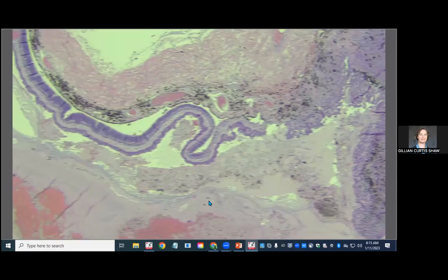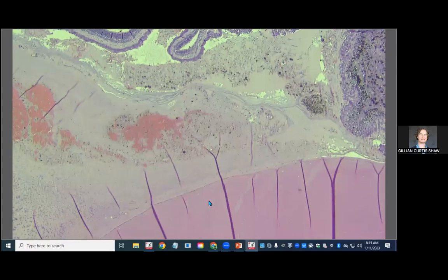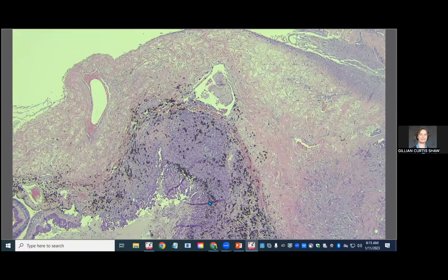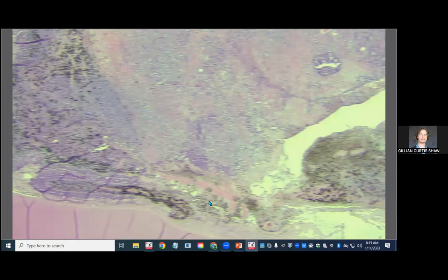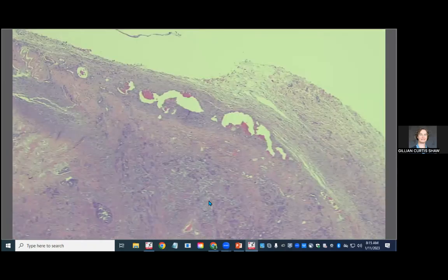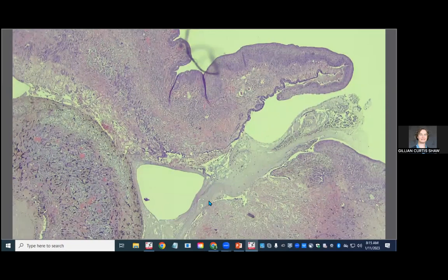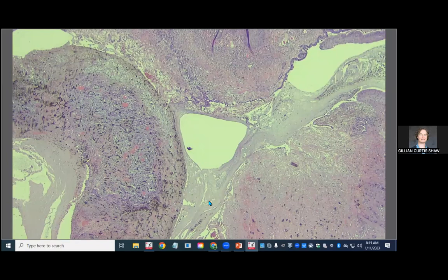There are neoplastic cells floating throughout the vitreous. And then obviously the neoplasm is invading into the uveal tract, which explains all of that cellularity that we saw in the iris. And then it is causing erosion of the limbal sclera and then busting through right here as the sclera can't hold itself together anymore. All right.